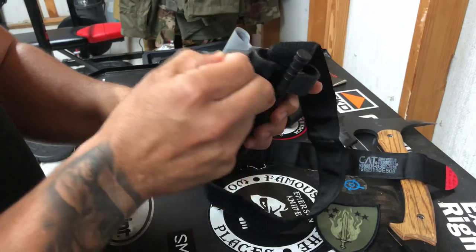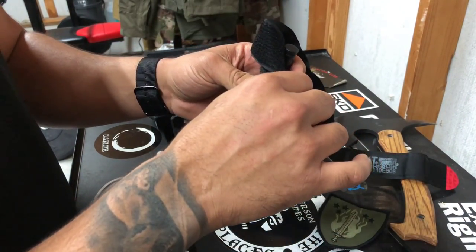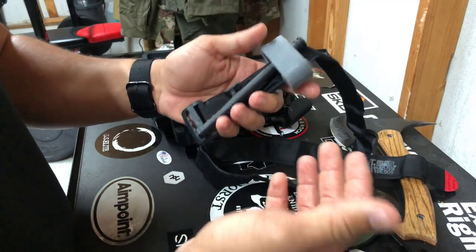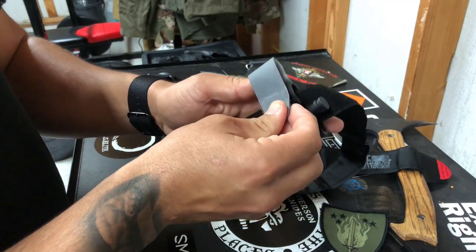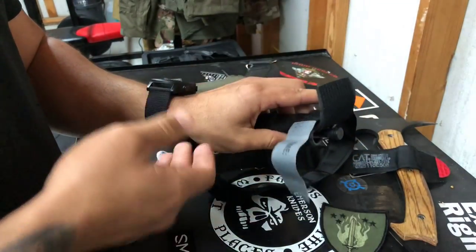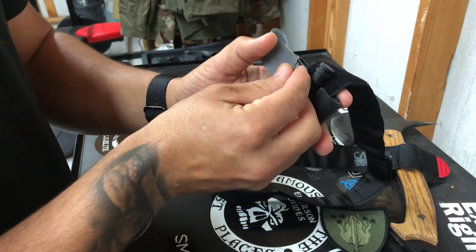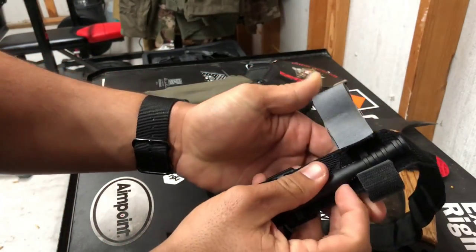There are three ways to stage this time strap. One way I've seen a lot of cops do stateside is they actually cut it off completely. Their thinking is: "I'm not overseas — help is minutes away compared to hours, so we don't need to write a time." I don't really recommend that. The second way is to have it flushed. I also don't recommend that, because once this thing is applied, I'm going to take it and put it all the way across.